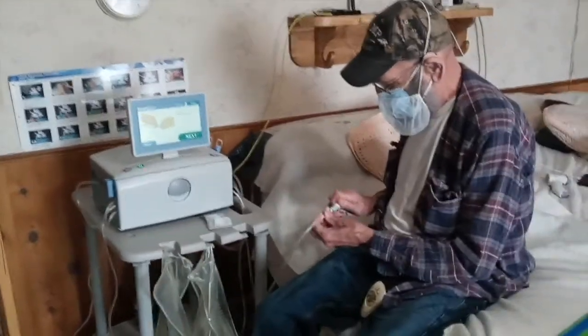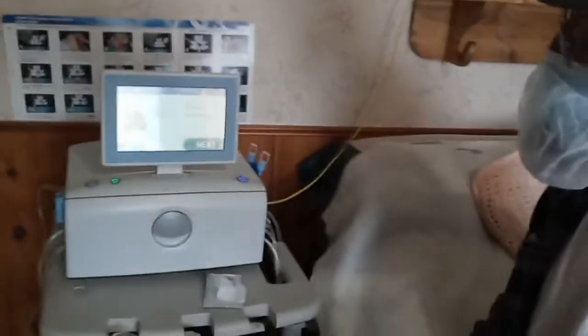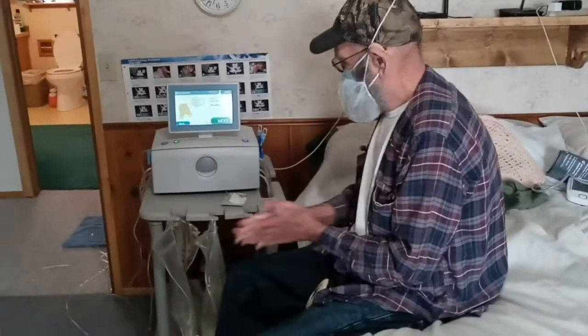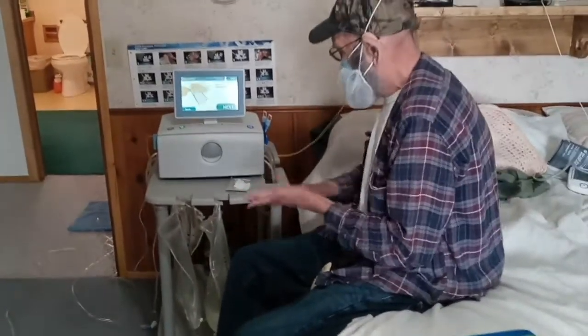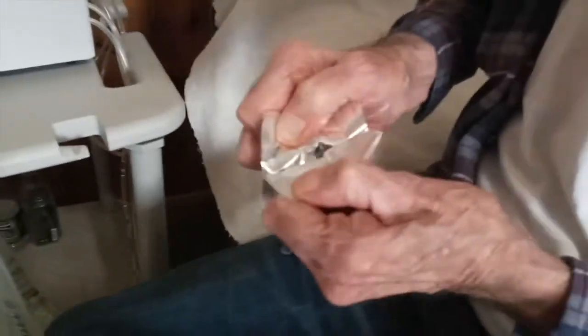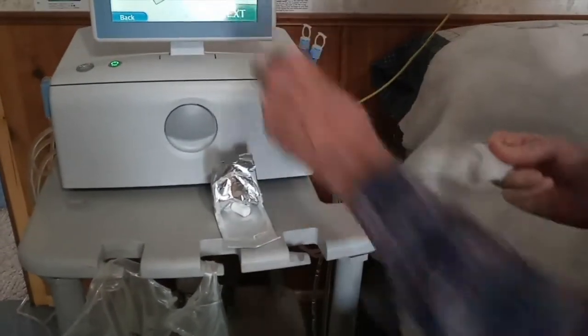Close the transfer set. Clamp the patient line. Put on mask, then disinfect hands. Open a new disconnect cap. Disconnect and recap the transfer set.